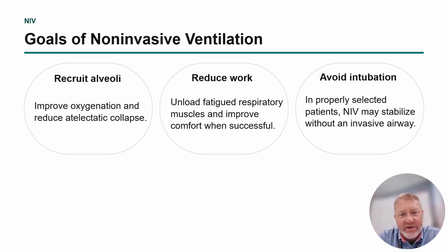So for non-invasive ventilation, in my RCP 131 class I spent about a month going over it, and here I've got a few minutes. So let's blow through it, and I'm happy to answer questions if you have them afterward. So the goals of non-invasive ventilation. Non-invasive ventilation includes CPAP and BiPAP. CPAP is continuous positive airway pressure.